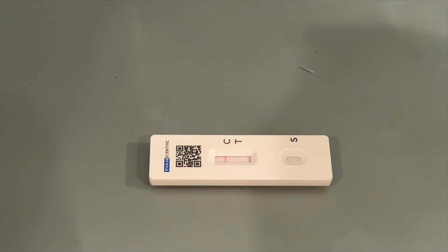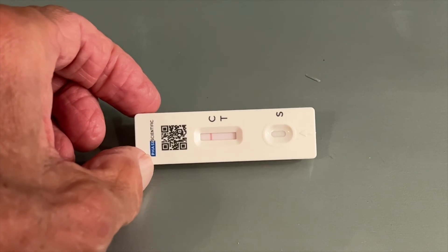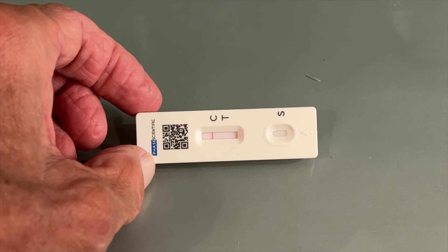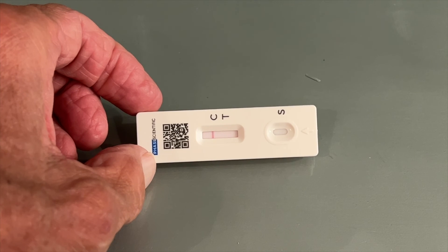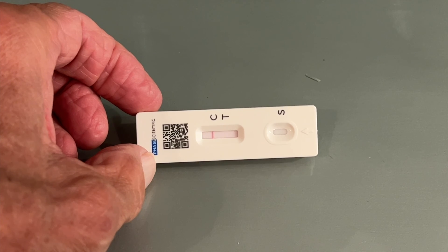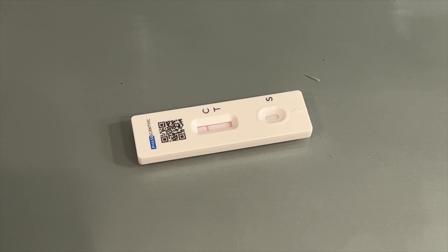According to this, it looks like I am negative — but I've got to say I don't know if I can trust this or not. I think the viral load is probably more in my throat than my nose. It says it doesn't detect any, so we're going to try Lynette and Christine next and see how they do.